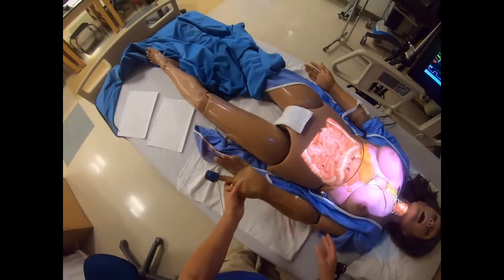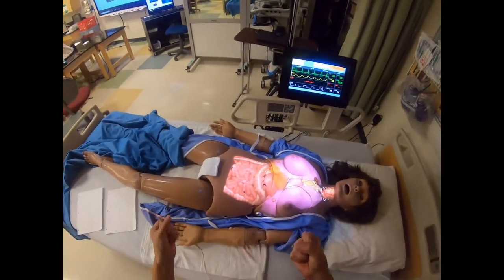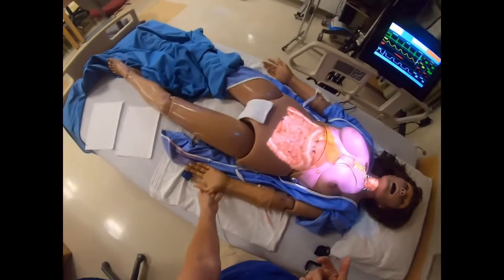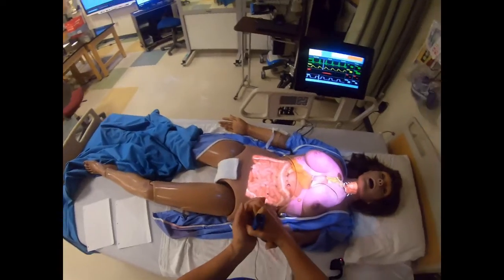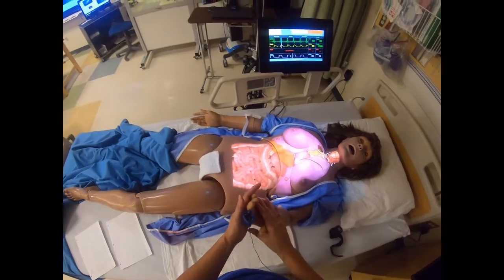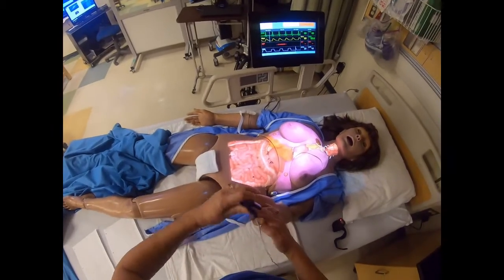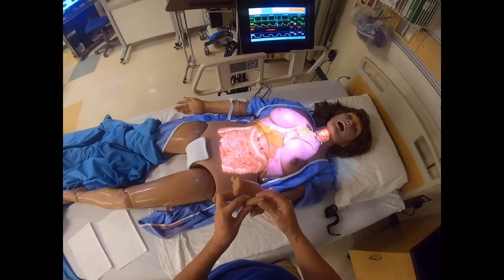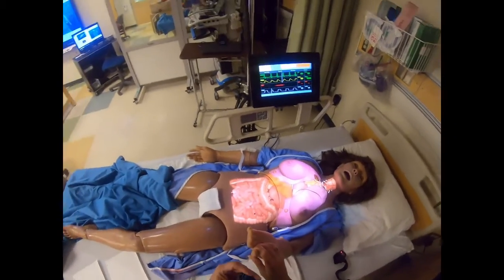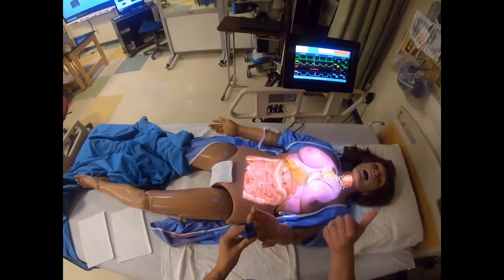Fingers are usually the ideal place that we like to monitor our pulse oximetry. Some things that might cause us to have false readings or not be able to get a very good reading would be cold fingers, because we are not getting enough circulation to the fingers themselves. Also, people may have fingernail polish on or fake nails, and nail polish will also give us false readings, false elevated readings actually, or it won't pick up the percentage of oxygen at all. It will not pick up a pulse.